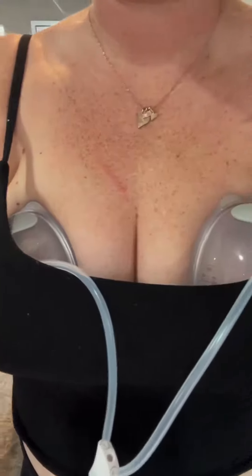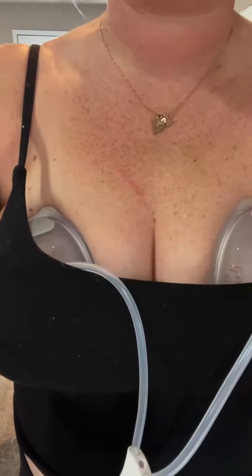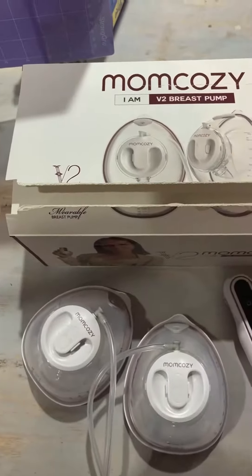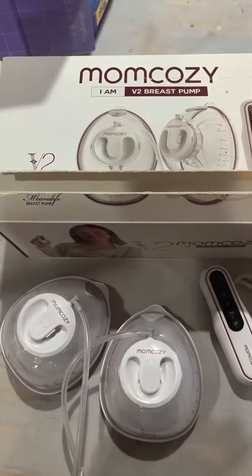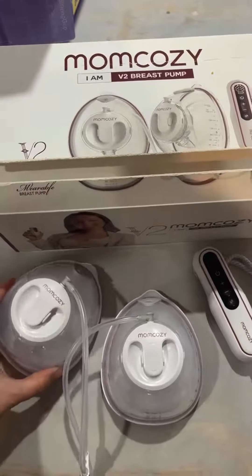This is what they actually look like inside of a bralette, so you can kind of see that they sit pretty nicely and they're not going anywhere. I know you have a lot of options when it comes to hands-free breast pumps, but if you're looking for a really great, easy, user-friendly option, Mom Cozy is definitely one to check out.